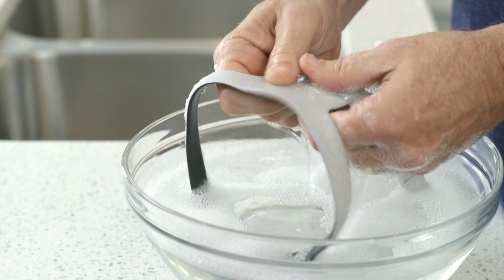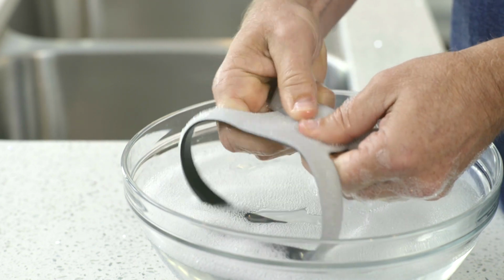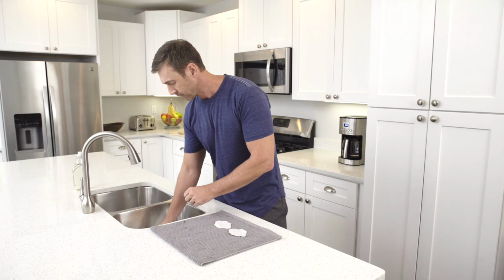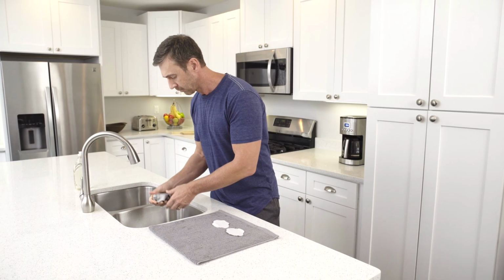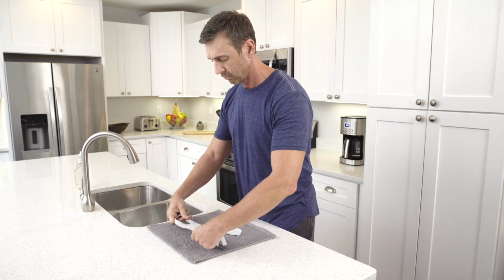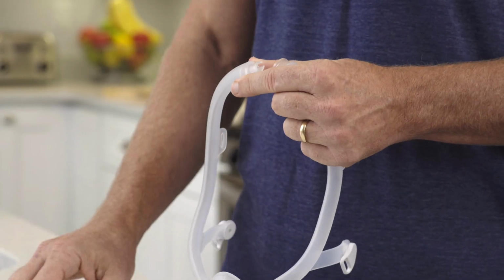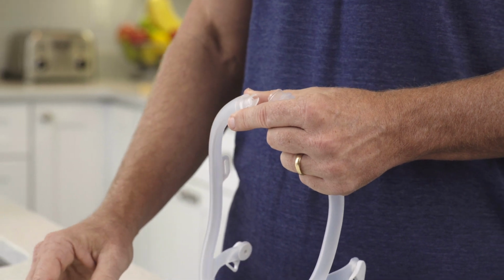Hand wash the fabric headgear and sleeves once per week using mild dishwashing detergent. Spread the clean, wet fabric parts out flat or hang them on a line to dry. Do not use a clothes dryer. Inspect your mask regularly for damage or wear, such as cracking or tears. Discard or replace parts as needed.